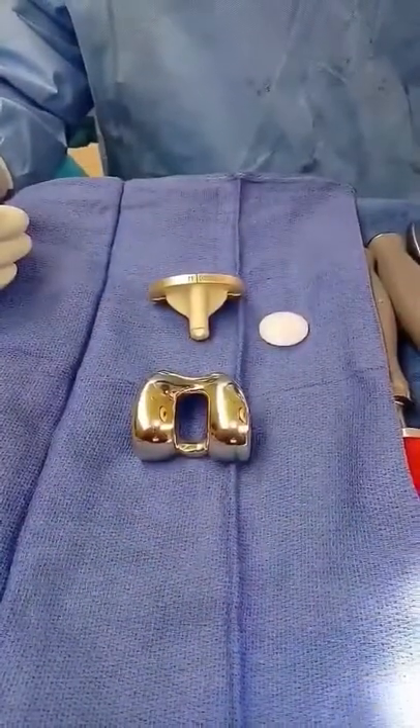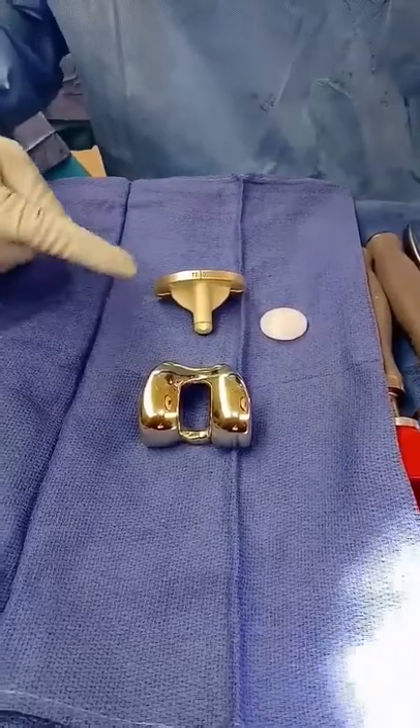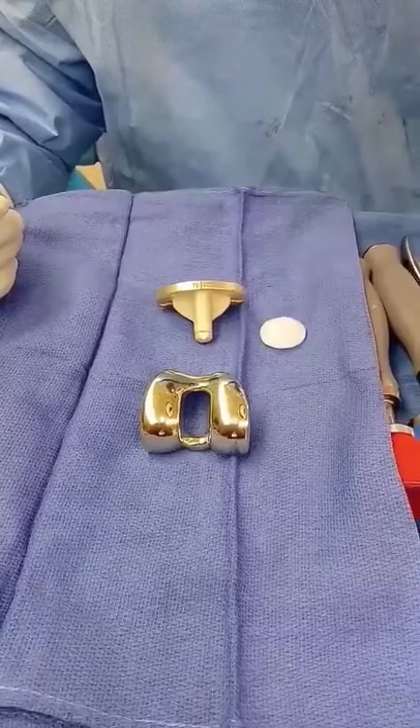The surgery is performed with our standard techniques using computer navigation and our other instrumentation. You can see the implant is actually gold in color. It has a seven-layer coating to reduce sensitivity to metals.